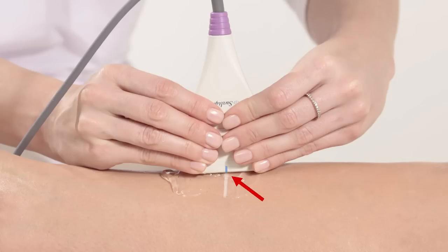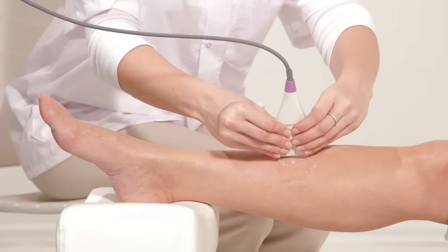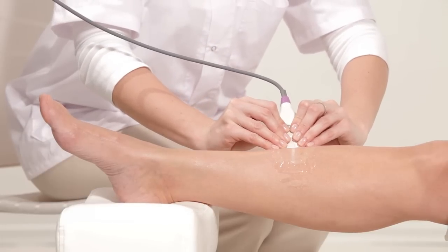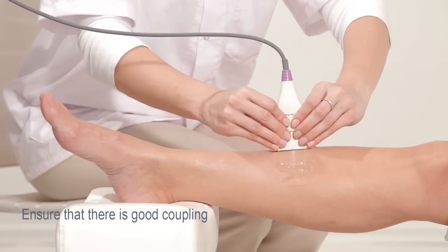Place the probe on the measurement area. Align the marking on the middle of the probe with the line on the leg. Hold the lower side of the probe with both hands. When positioning the probe, apply light pressure on the surface to be scanned. Ensure that there is good coupling between the skin and probe.